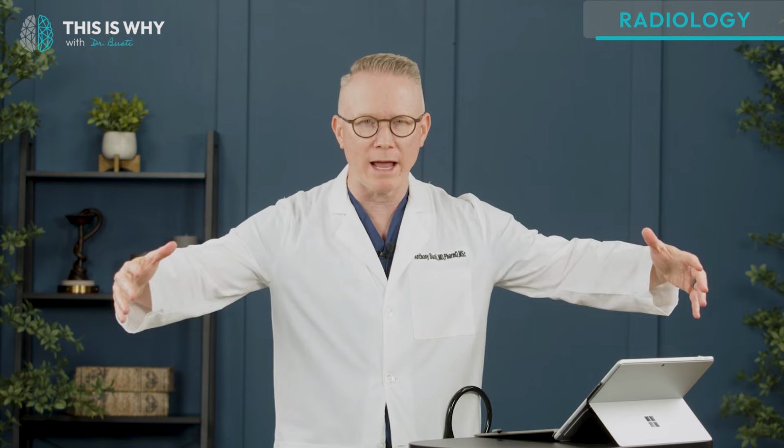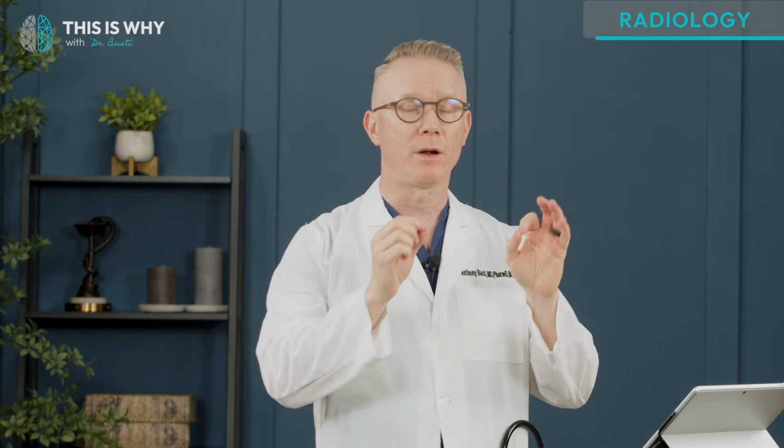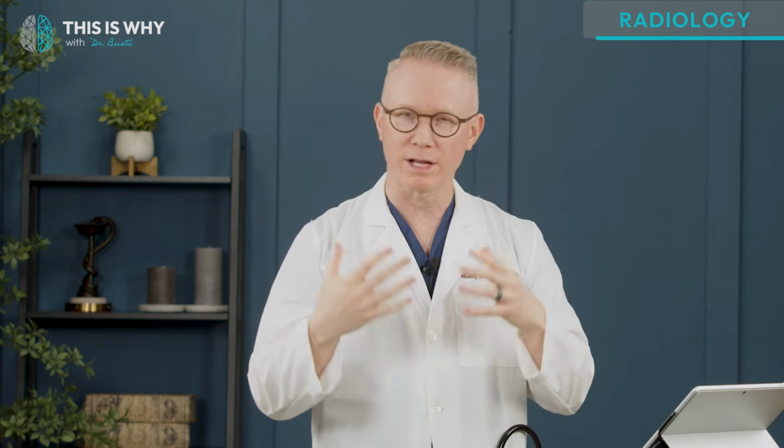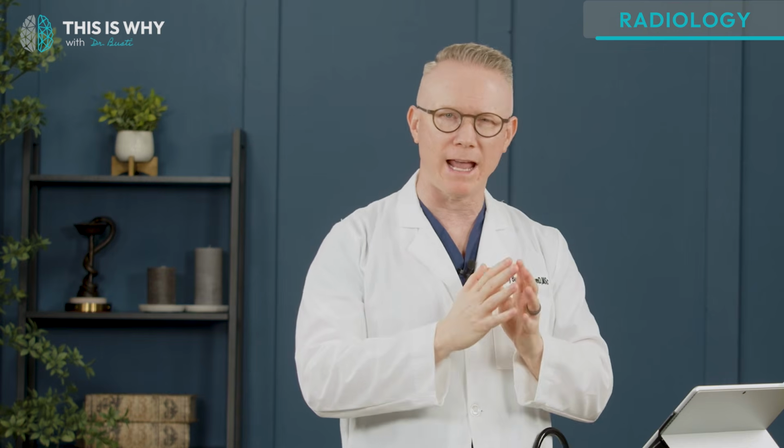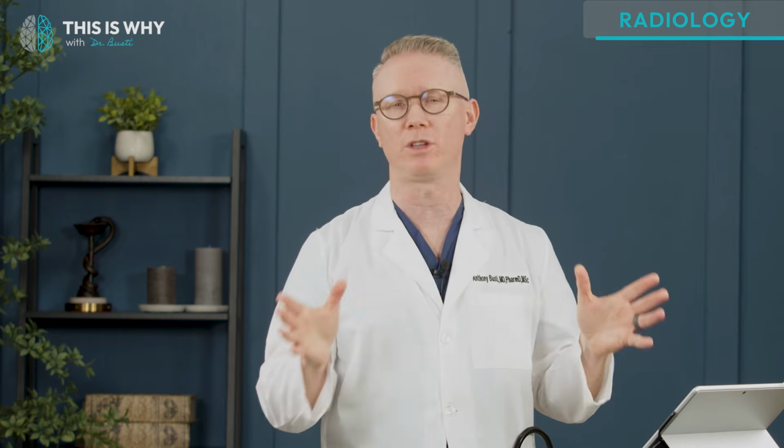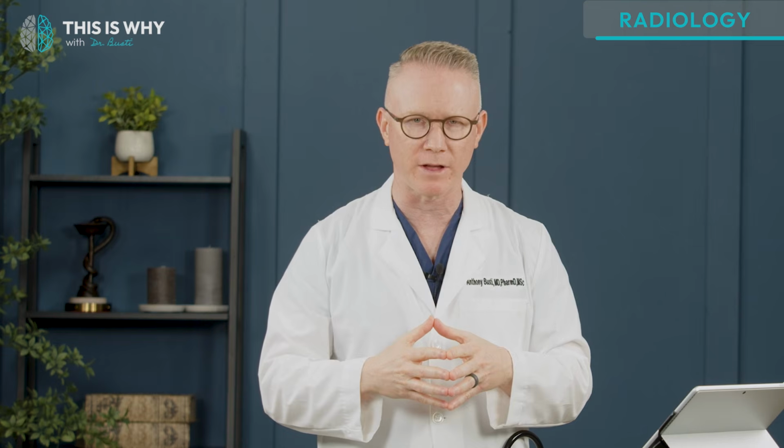versus a PA view, right? The arms typically are extended out and away because they're usually grabbing something like I showed you, where the detector plate is on their chest, and the scapula move out and around, and that opens up the lung fields, okay? Now remember, if you have cardiomegaly or a cardiothoracic ratio of 0.5 or greater on an AP, then you should really get a PA to verify that before you label or suggest the patient has cardiomegaly or even potentially heart failure, especially if this is concerning for a new finding.